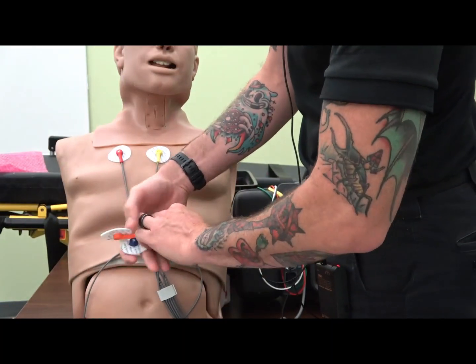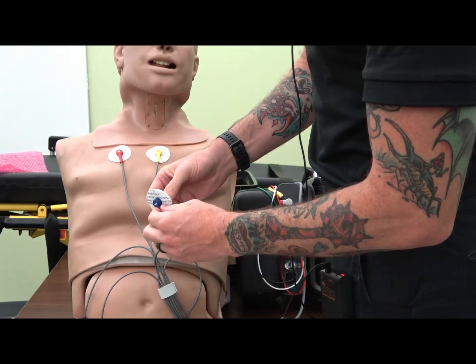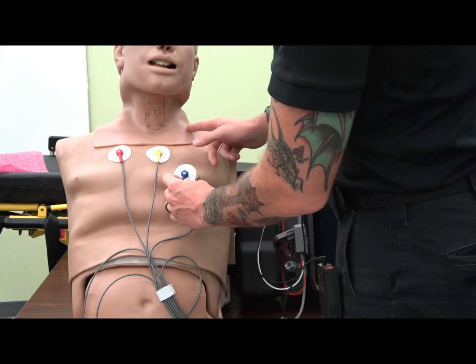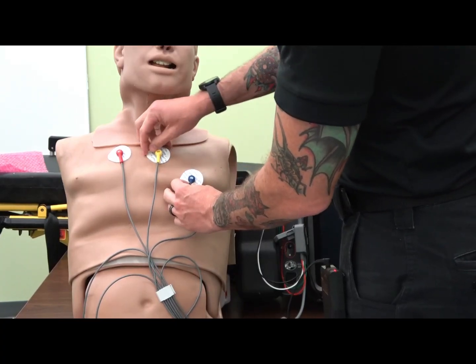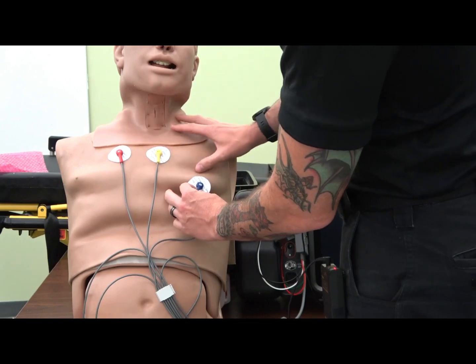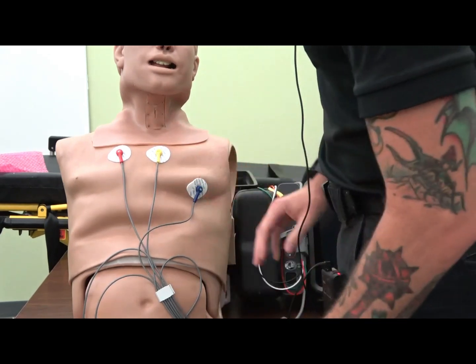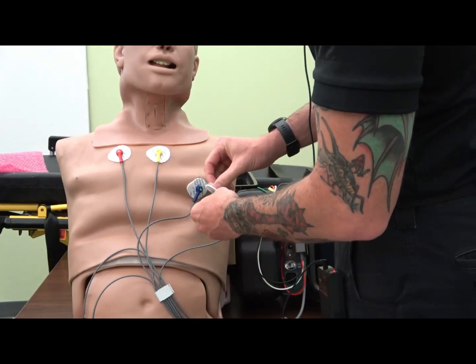I'm going to skip V3 for now. V4 is going to be at the 5th intercostal space, mid-clavicular line. So mid-clavicular, and probably right about here. V3 is going to go between V2 and V4.